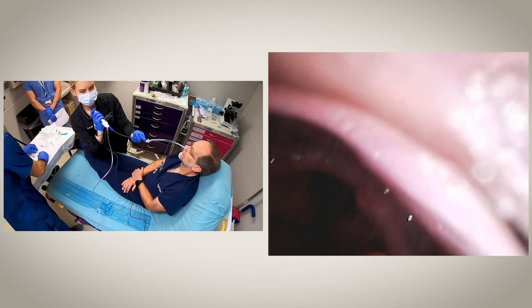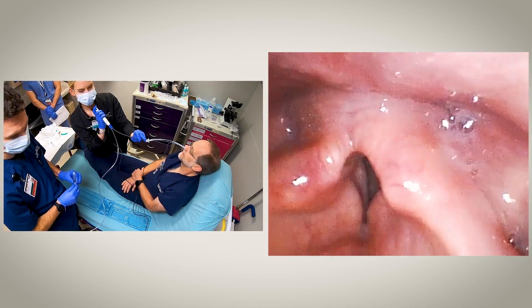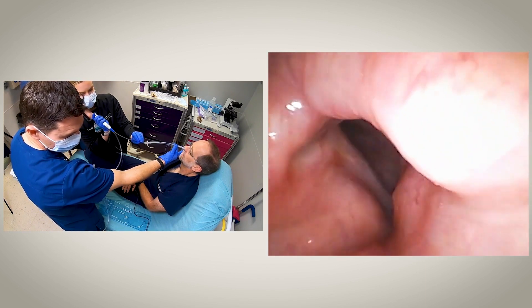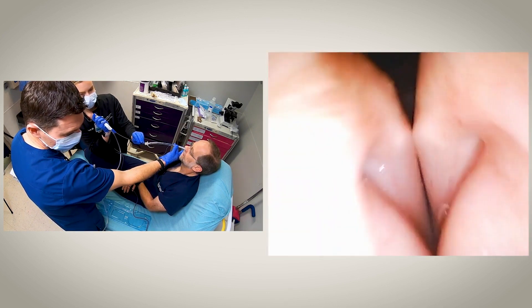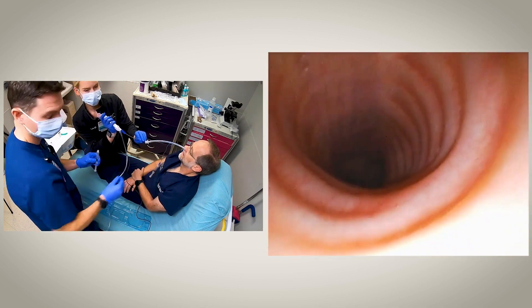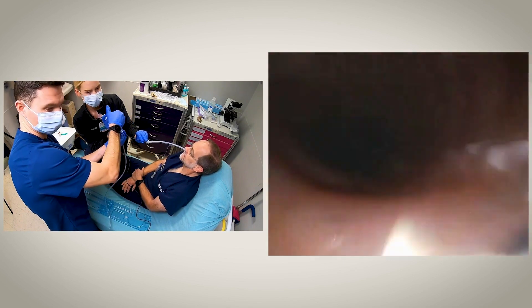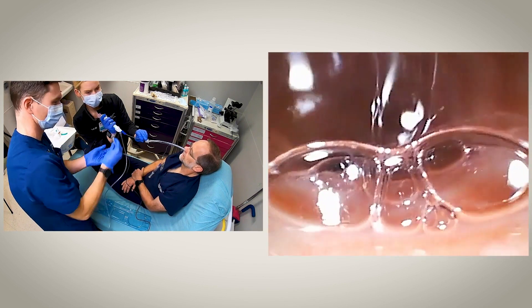Once the cords have been anesthetized, we will now advance the scope through the vocal cords. If your patient is not sedated, ask them to breathe in at this point to keep the cords open. Otherwise, you're timing it to advance the scope through the cords as they open, down into the trachea. We're now going to drive the scope down to the carina and administer our last dose of 4% lidocaine through the bronchoscope to anesthetize the trachea.